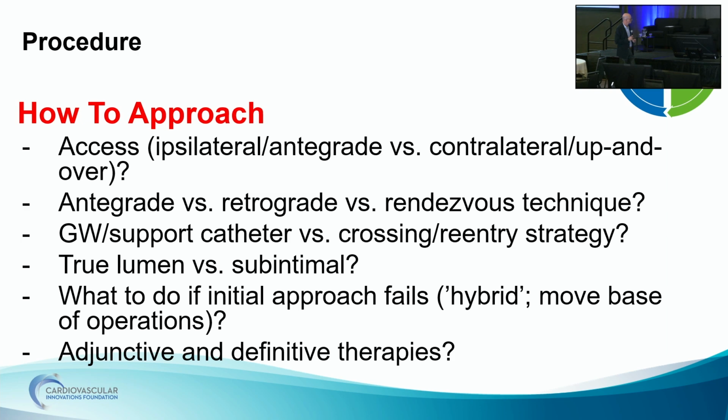And Herb, before we show, we've got a surgeon right here. So if the SFA is good all the way down, is it a short bypass from the distal SFA to the tibial if that was needed? If, let's say you can't do this, tell us the surgical options if you would.